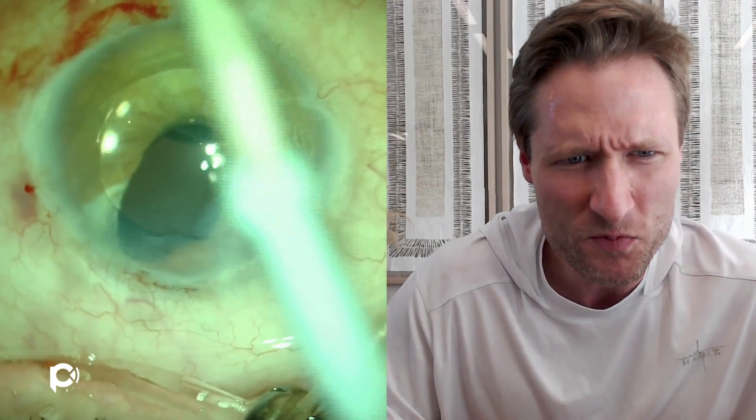Now for the good part: putting the DMEK graft into the eye. The anterior chamber is reformed with balanced salt solution. You'll notice some air peeking out from behind the iris underneath the ACIOL — this is extremely common in a post-vitrectomy eye, especially one with an iris defect or ACIOL, and it can complicate the surgery. I'm hydrating the wounds before injecting the graft because in these vaguely unicameral eyes with a post-vitrectomy and large iris defect, a soft eye could cause the graft to get sucked down into the posterior segment. You want to be absolutely sure the wounds are not leaking.